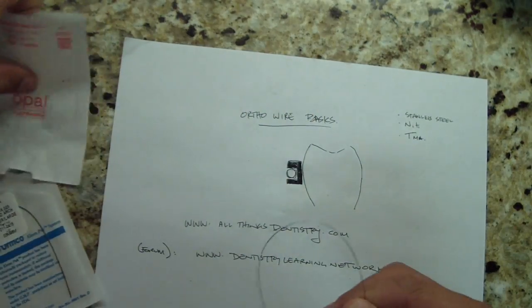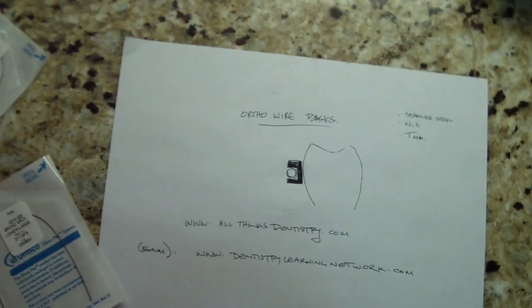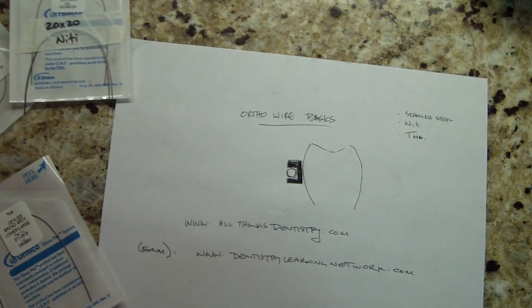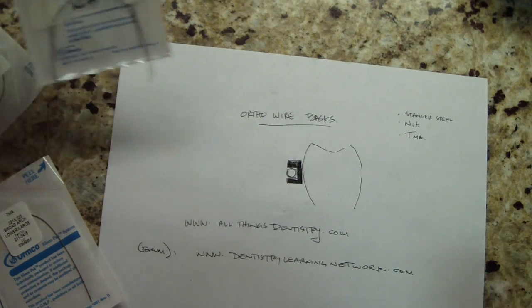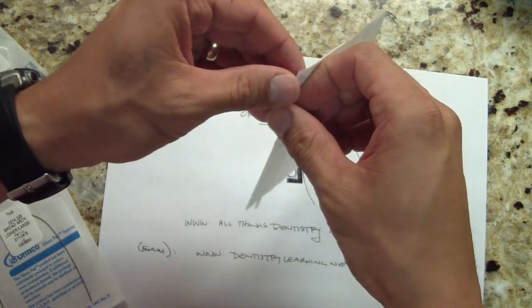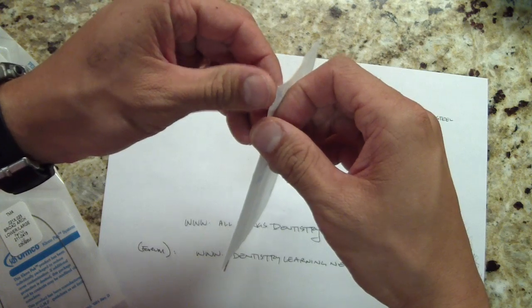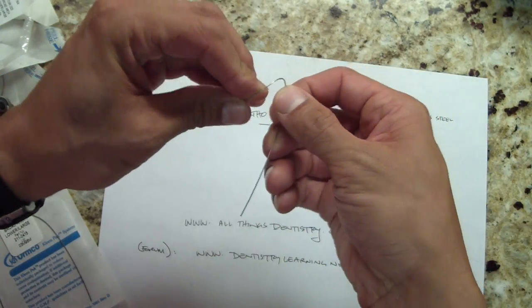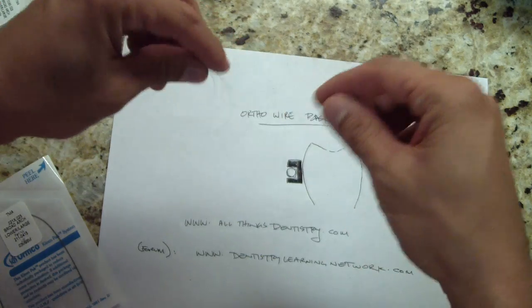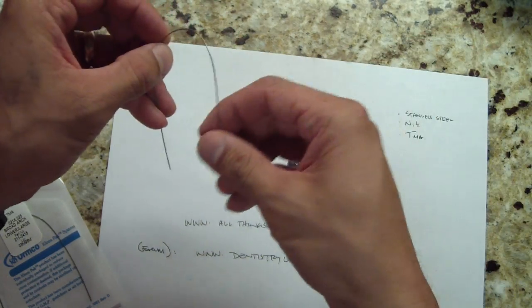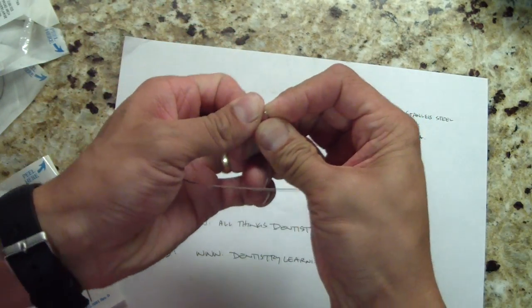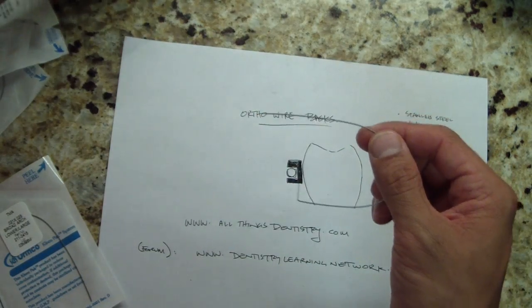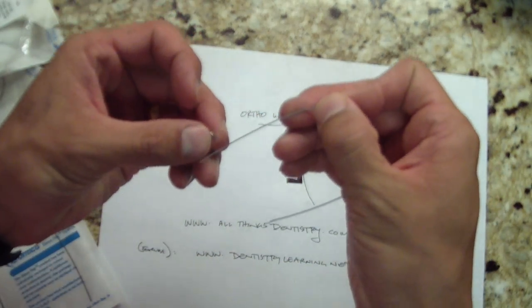So that's nickel titanium Ni-Ti, and the last one is TMA. TMA is similar to Ni-Ti but it can be bent just like stainless steel. We say it's more like a finishing wire and it's difficult to slide things on. You can see how it kind of goes back to its original shape, but you can actually put a bend in it if I had the right pliers.